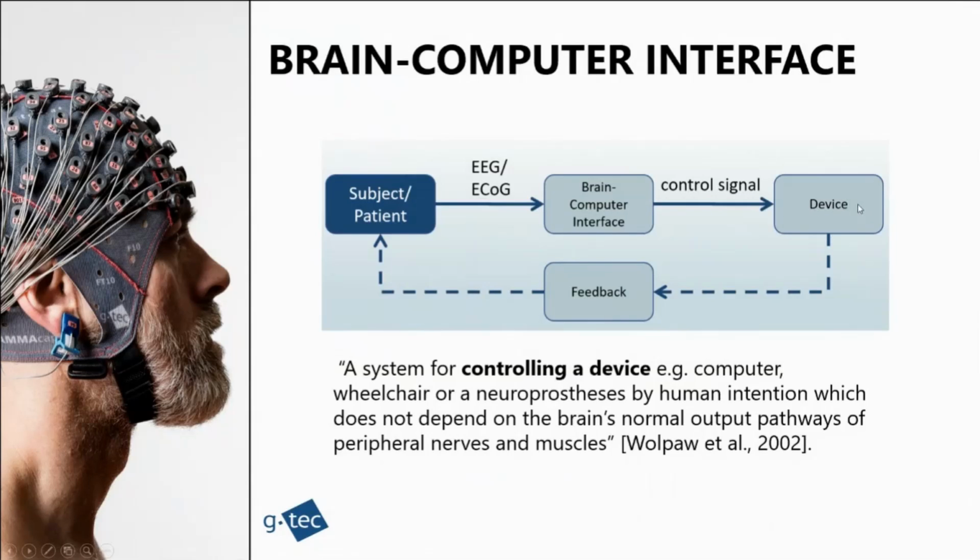The electric stimulator stimulates the left or right arm, depending on the signal strength. So the feedback is the electric stimulation. The stimulation actually helps the subject to activate more in the motor region, as a form of recovery of the brain for linkage between the muscle and the brain. So the BCI repeats the algorithm again and again for 240 times, forming a closed loop system.